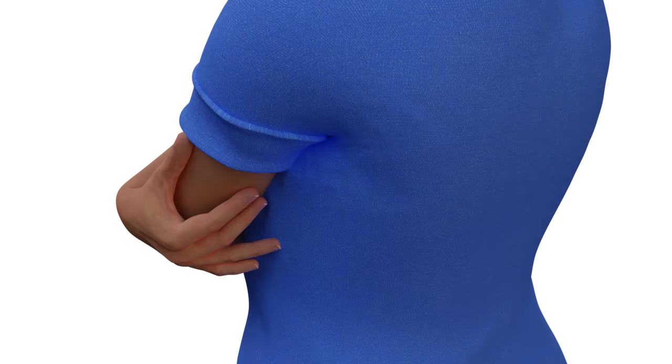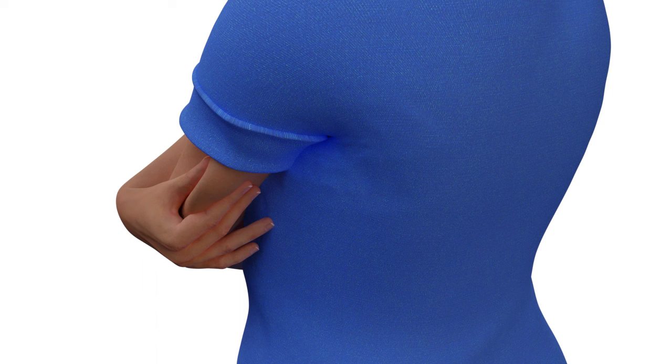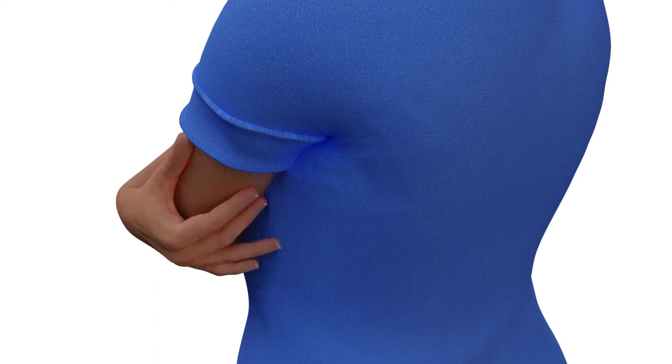You'll want to choose an insertion site that has adequate fat. For the best sensor performance and to avoid accidental sensor removal, do not insert the Simplera sensor into muscle, tough skin or scar tissue, areas that are constrained by clothing or accessories, or areas subjected to rigorous movement during exercise.